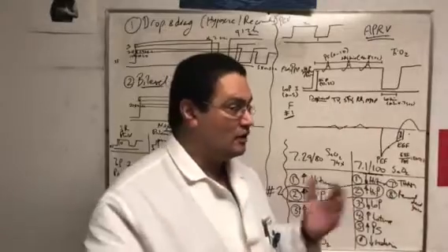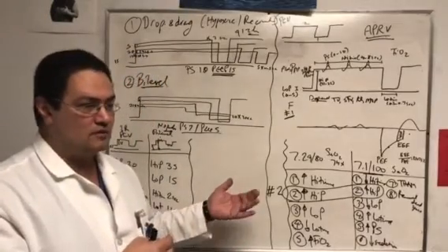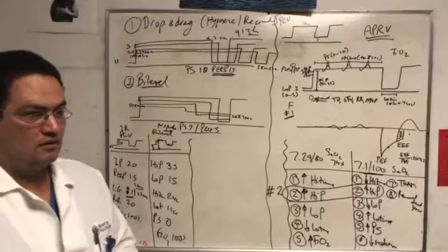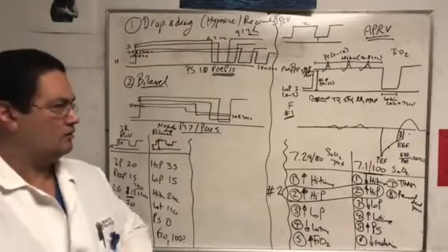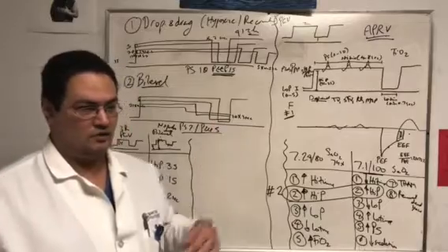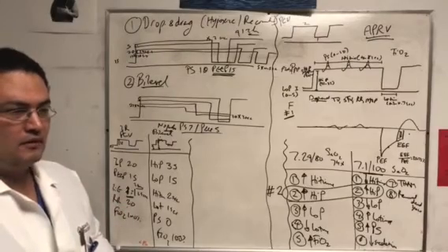Let's line her up, and it's not septic shock. It's just that her lungs are healthy, and her heart is empty. And then within minutes, maybe an hour, she'll have a cardiac arrest, right? Unless we flood her with fluid and do something else, right? But that's dangerous. Luckily, obviously, when we use this mode in an ARDS patient, no pressure is transmitted anywhere. They don't even drop their blood pressure because of how stiff the lung is, right?